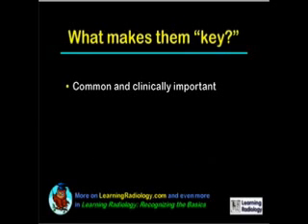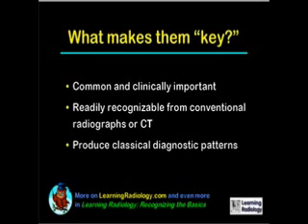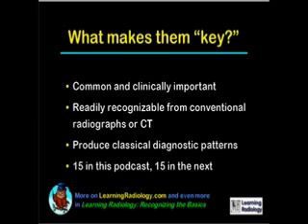What makes these diagnoses key? Well, all of them are common and clinically important. They're readily recognizable from conventional radiographs or CT. They produce classical diagnostic patterns. There will be 15 included in this podcast and 15 in the next. And you can get more information on any of the material discussed on LearningRadiology.com, and even more material in the textbook Learning Radiology: Recognizing the Basics.